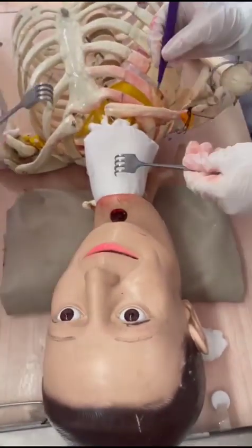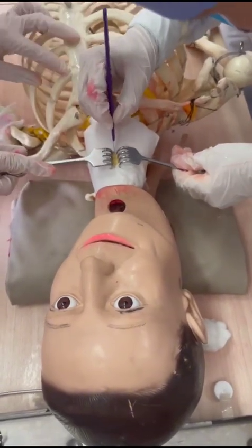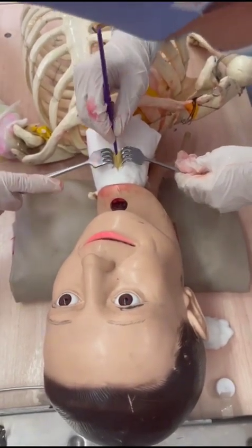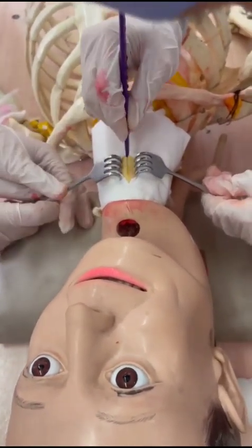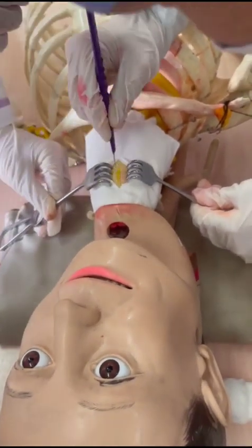First of all, the neck is placed in an extended position. The skin is prepared with antiseptic solution and appropriate surgical drapes are placed, maintaining sterility. The thyroid notch, the lower part of the cricoid cartilage, and the suprasternal notch are marked. The tracheostomy incision is marked as a transverse line placed halfway between them. Infiltration of local anesthetic mixed with adrenaline solution can be applied after these landmarks are known.